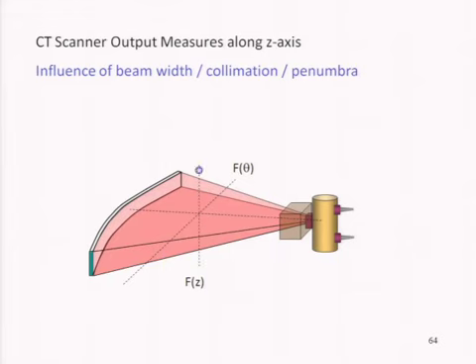And let me preface this section by saying when you measure fluoroscopy, when you measure radiography, when you measure mammography, you're really measuring the entrance beam to the patient. In fluoro, we use a phantom just to stimulate the automatic brightness control to get that number, but we often calculate mR per mAs or milligray per 100 mAs on a radiographic system and things like that. So generally speaking, you're looking at an external measurement on radiography, mammography, and fluoroscopy, whereas in CT, we have traditionally used a phantom and made internal measurements.